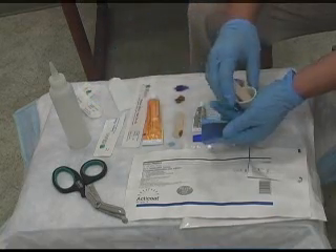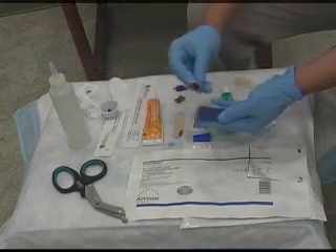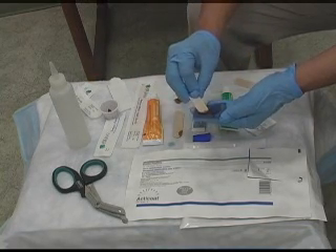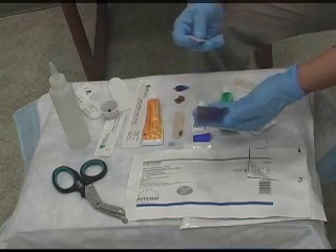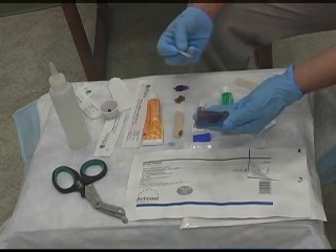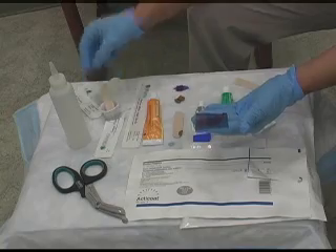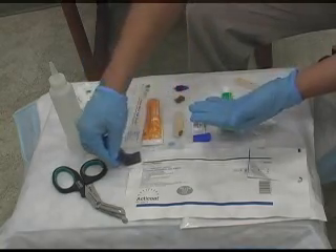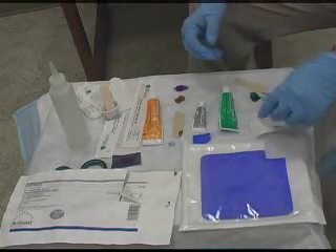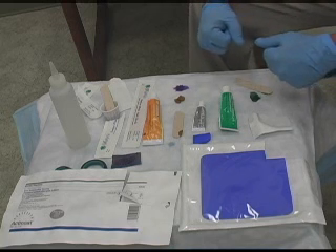Another thing we use Acticoat with is the ABBA. You can smear the ABBA on the silver itself and then place it directly on the wound, using the anti-biofilm agent with the bacteriostatic dressing to take care of infection at the same time while allowing the healing process to continue. These are just some of the products that we use here at the Wound Care Center. If there are any questions as to how to use these products, you can always reach us at 806-793-8869.